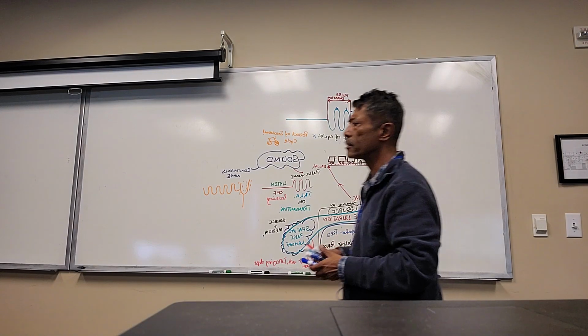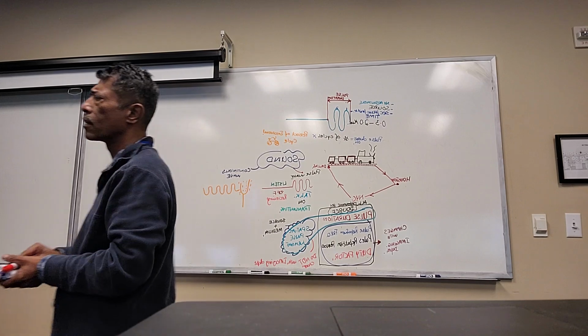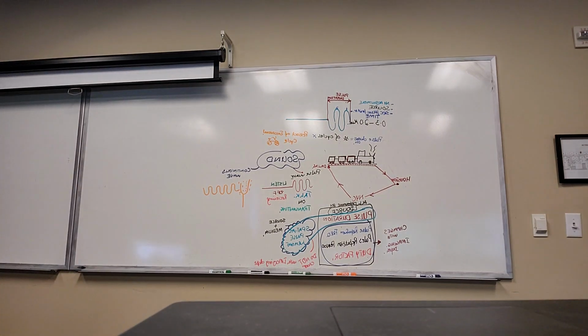What kind of cycles do we need for diagnostic medical sonography? Fewer number, shorter period of individual cycle.